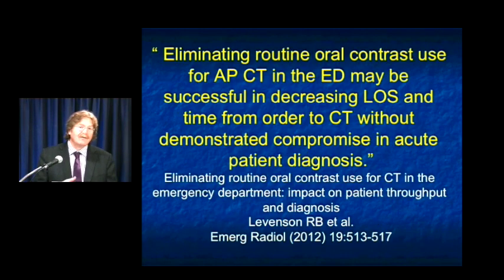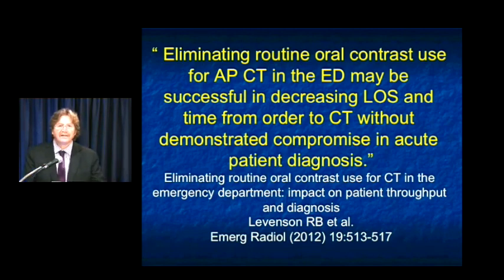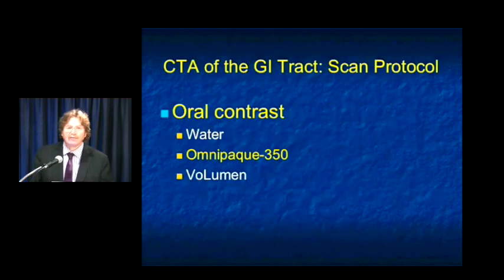And also now, in the ER setting, the ER docs, as you are all aware, don't want to even wait 30 seconds. They want to increase the throughput time because they get paid based on throughput, and often it compromises scan quality. Now, can you eliminate oral contrast? I mean, for stone protocol, you don't need oral contrast, but for many things, oral contrast is critical, so it's this balancing.